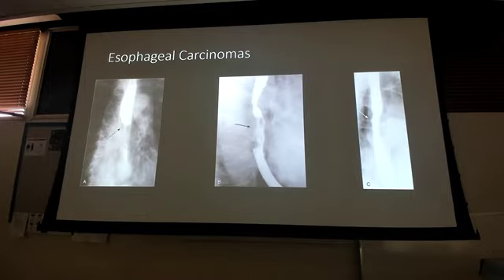So here are some of the different ways it's going to look. And you're like, how do I know this is cancer? You don't off of just the image, right? You don't off of just the image. You have concerns of it based off of the patient history and the image together, okay?